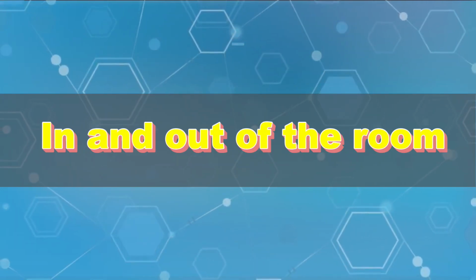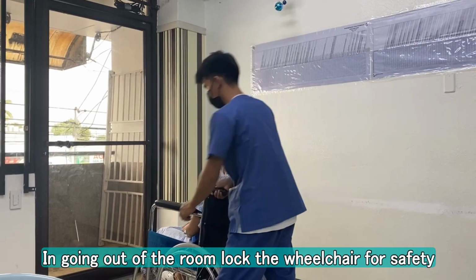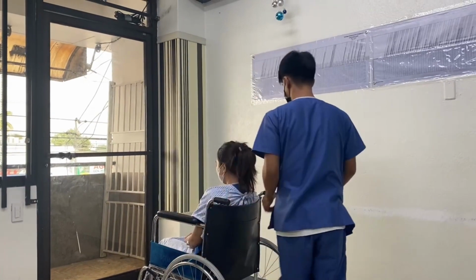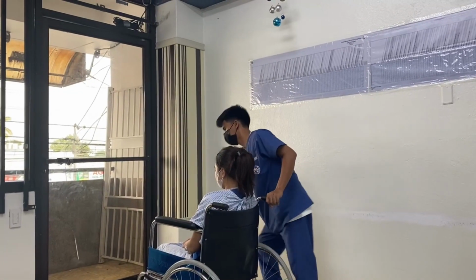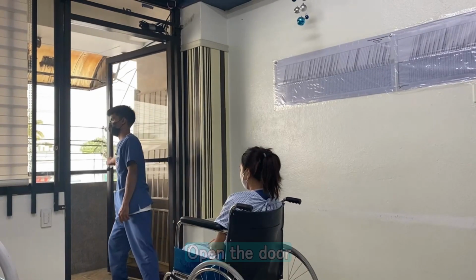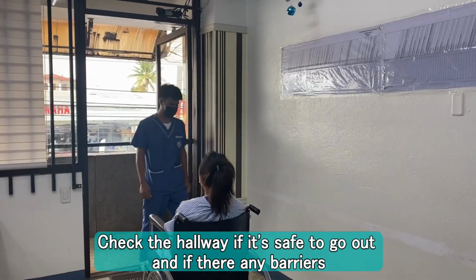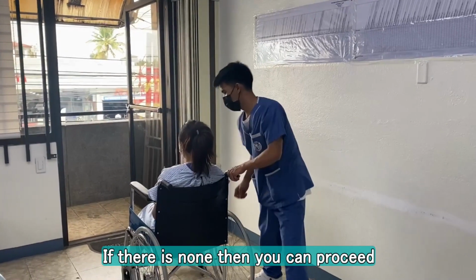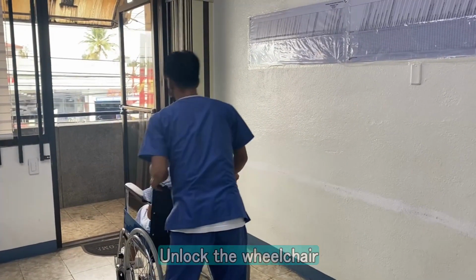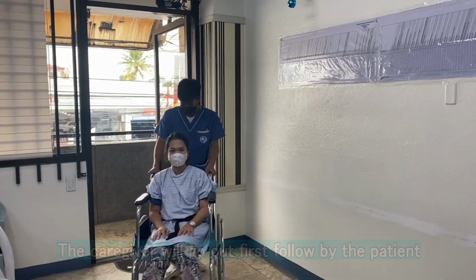In and out of the room. In going out of the room, lock the wheelchair for safety. Open the door. Check the hallway if it's safe to go out and if there are any barriers. If there is none, then you can proceed. Unlock the wheelchair. The caregiver will go out first, followed by the patient.